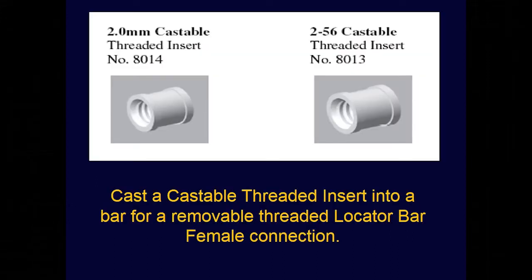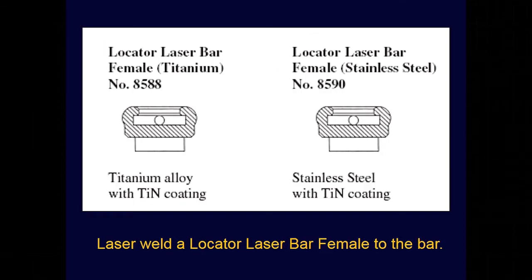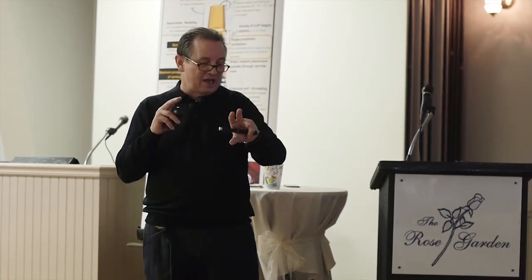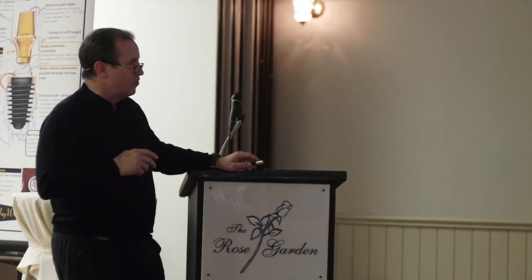So we're making a bar pattern. These are the castable patterns that are incorporated into the bar. This is 2.0 millimeter diameter. If you accidentally over-engineer this in threading it, you can go to the next diameter, a slightly larger screw, for situations where something's been over-tapped. And it comes with these tap drills, the threading tools. We keep all this in inventory because we use this stuff from time to time. But as I said, we really don't do nearly as many bars as we used to do. It's a lot more about individual locator attachments. So I'm going to kind of breeze through this because I want to get to some cases.